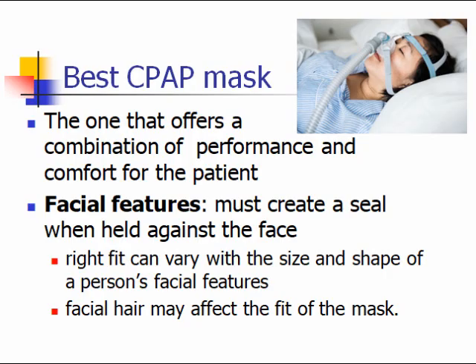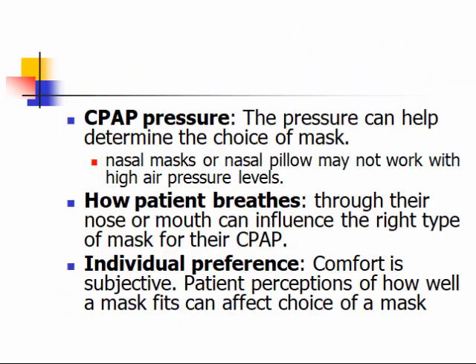Patients with facial hair are going to have more problems with the fit, with the leaking of the air, because the hair tends to mat down, tends to allow the air to escape from the mask. The choice of CPAP mask may be affected by the pressure that the patient needs to keep his airway open. A higher pressure makes it difficult to use nasal masks or nasal pillows. They may not work with the higher pressure levels.